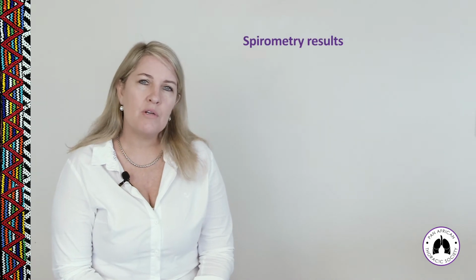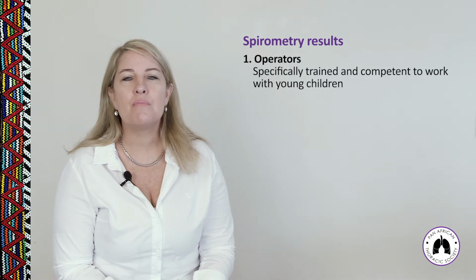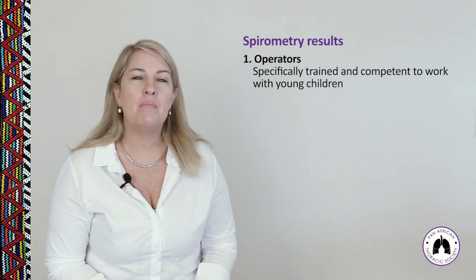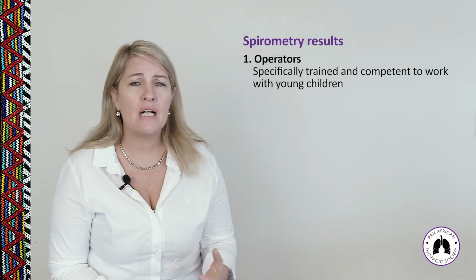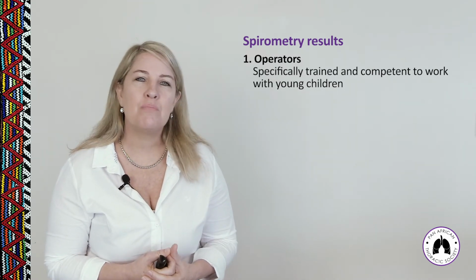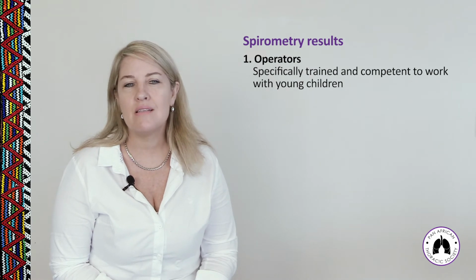With spirometry, there are 4 factors that work together to produce accurate and meaningful test results. The first one is the operator. The operator needs to be someone who is specifically trained and competent to work with children and who is familiar with pulmonary function testing in children. This person must be able to give detailed instructions, to encourage the child, not to be intimidating, and to give visual feedback after each maneuver to show the child what they're doing, what they need to do to improve the testing technique so that we get the very best test results.